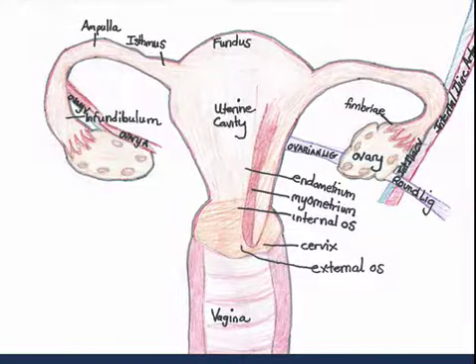To get a better idea of what we will cover today, let's go over the anatomy of the uterus. First, what we will see is the uterine fundus at the top of our view. The uterine cavity leads to the bulb-like cervix, and finally, that connects with the muscular vagina. The stripe of the vagina may be visualized on transabdominal ultrasound.